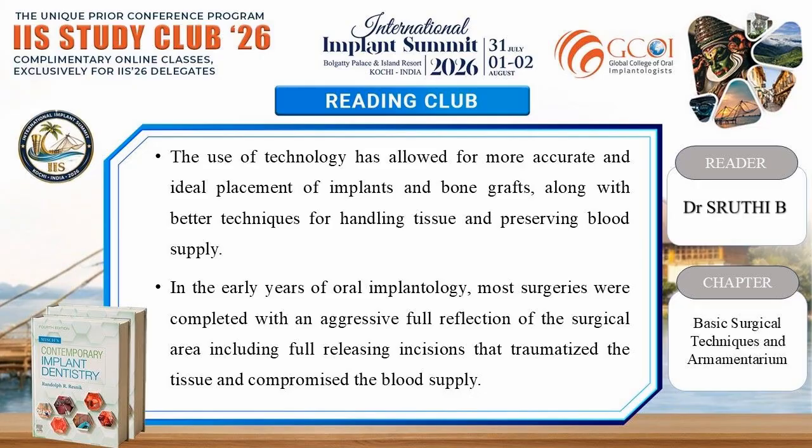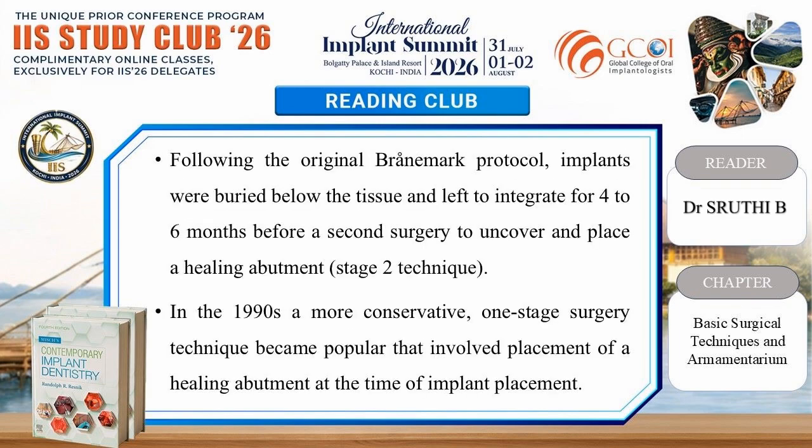In the early years of oral implantology, most surgeries were completed with an aggressive full reflection of the surgical area, including full releasing incisions that traumatized the tissue and compromised the blood supply. Following the original Brånemark protocol, implants were buried below the tissue and left to integrate for 4 to 6 months before a second surgery to uncover and place a healing abutment, that is stage 2 technique.